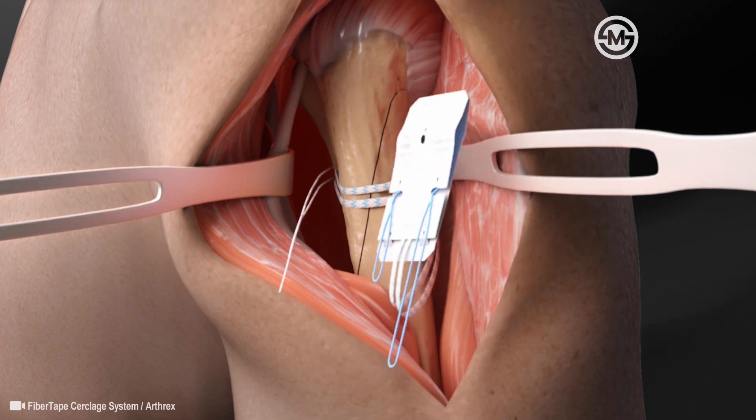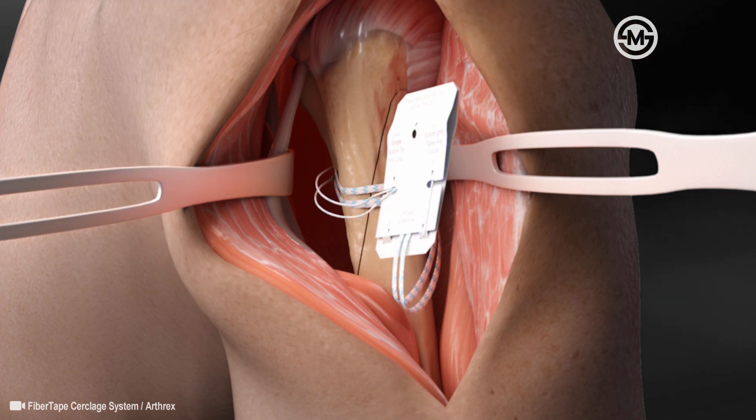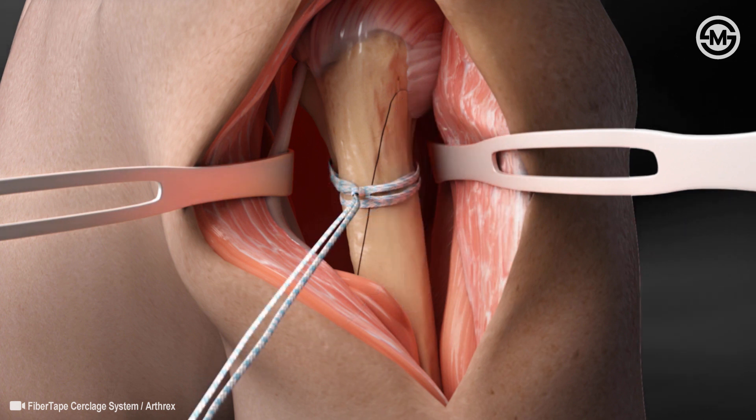Once the Fiber Tape Circlage Suture is passed, the suture tail is loaded through the pre-tied racking hitch knot. A card is included to help facilitate the loading of the suture. The single tail is loaded into the loop and is then pulled through the card. Once the tape portion engages the knot, the card can be discarded. The suture should then be hand tightened around the bone.